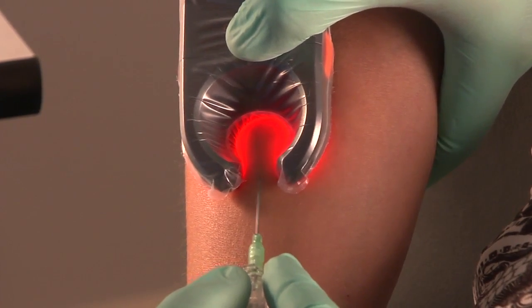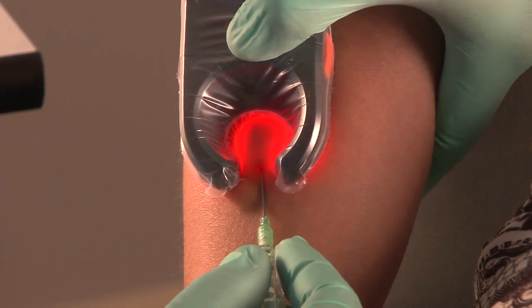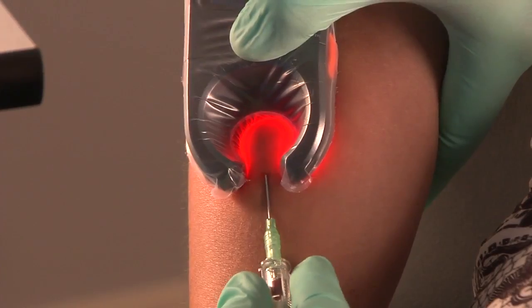After closing the vein, slightly push back on the device. This will stretch the skin, raise the vein, give it traction and prevent it from rolling. You are now ready to access your fully secured vein.